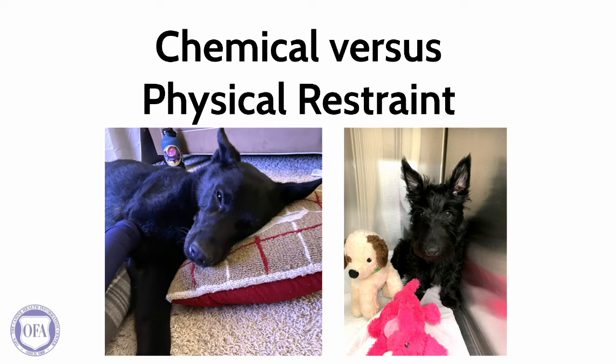This refers to whether the dog is entirely awake versus under some degree of sedation or anesthesia. Chemical restraint is not required for evaluation. However, the recommendation from the OFA is that the dog is sedated or anesthetized to the point of muscular relaxation. This allows for proper positioning of the patient, which in turn provides the best chance of the dog receiving the most representative grade. You can imagine that taking images of the dog on the right here, as a young, energetic, and potentially nervous puppy, would be much more difficult while awake and wiggling than if he were sedated.